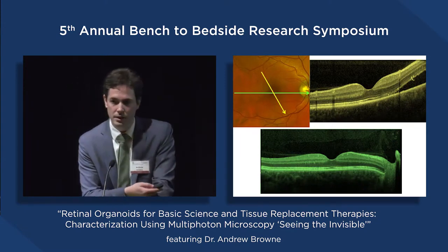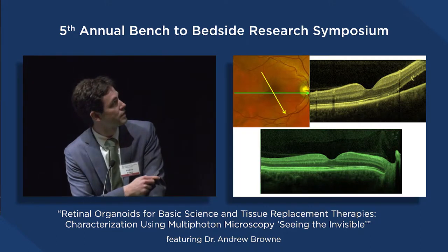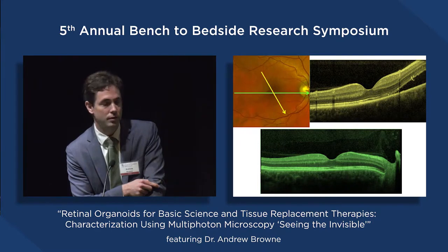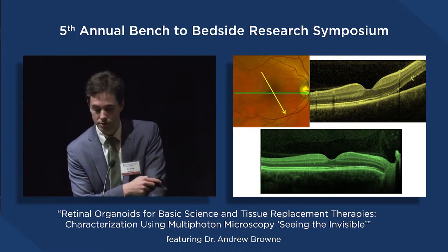We can then use OCT as well to look at the microanatomy of the retina. And certainly we've seen photographs where we have cross-sections of the retina here going straight through the fovea, showing beautiful vitreous, beautiful retina with a normal foveal contour and the blood vessels underneath the retina and a perfectly normal foundation. But if you change the angle of the OCT, you can see there's a huge abnormality here. And that corresponds to exactly what we saw as the abnormal area in the previous pictures.